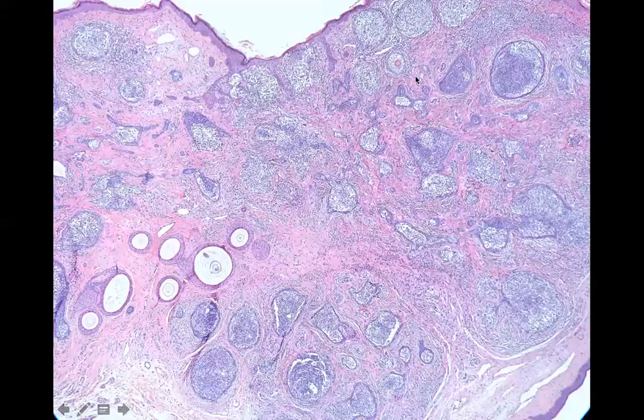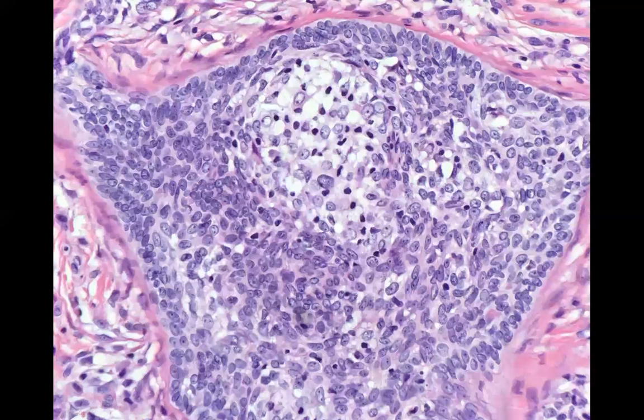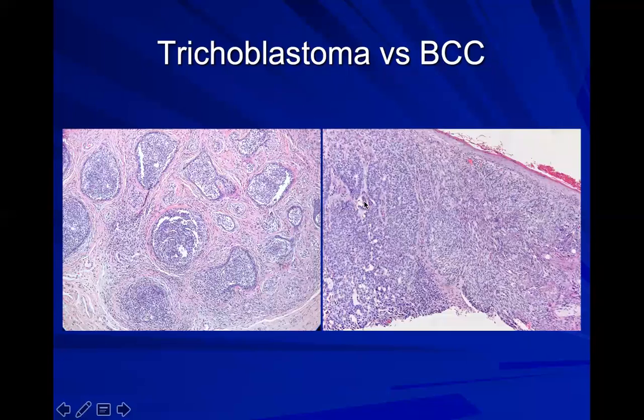Okay, here's another one. Blue balls, kind of looks like basal cell, but wrong stroma. All these little pale areas because they're chock full of lymphocytes. Okay, lymphadenoma. Here's an up close. See, your cells are pulling apart. You've got all the space and edema, lymphocytes, and then basaloid cells. So here's compared to a basal cell. So here you get a little clefting of the tumor from the stroma, and that's compromised by that myxoid type of stroma, whereas here it's more fibrotic.